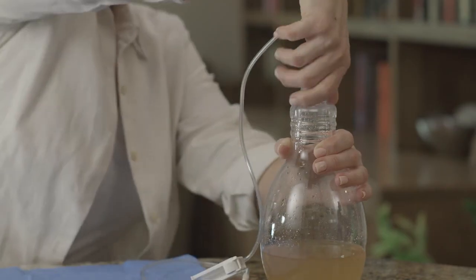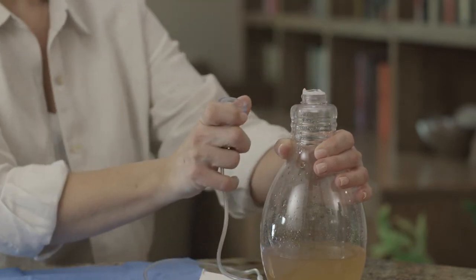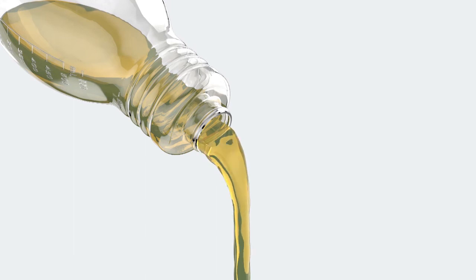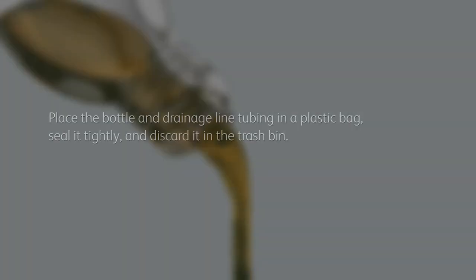Grasp the cap and pull it away from the bottle top, facing away from you to avoid any splashing. Empty the bottle into the toilet or sink. Then place the bottle in a plastic bag, seal it tightly, and discard it in the trash bin. Used Plurex bottles cannot be recycled.